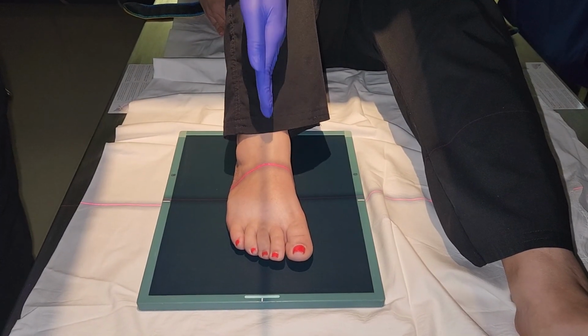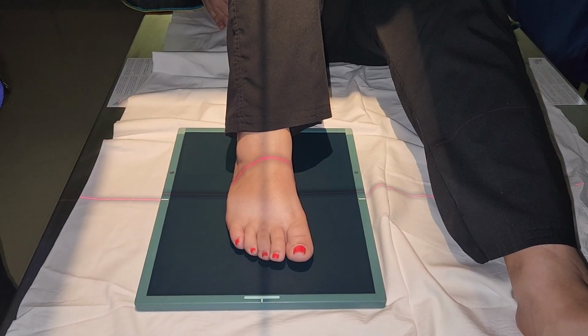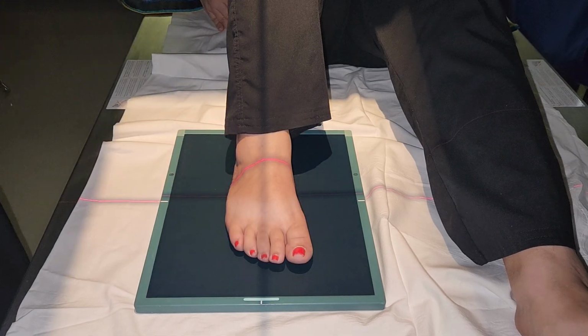Once again, coming straight down the leg, straight down the third, right? Foot nice and flat on the board, right? Not twisted one way or the other.